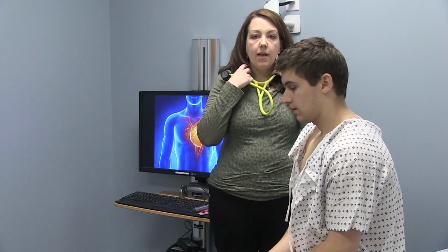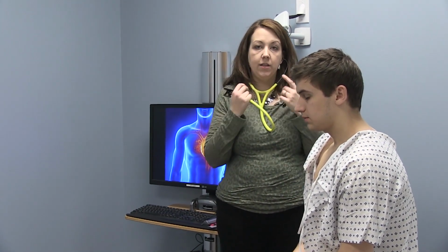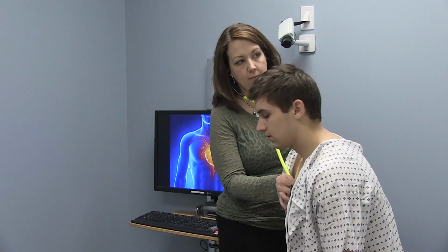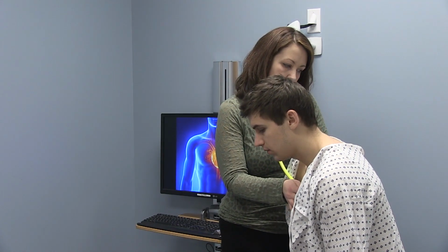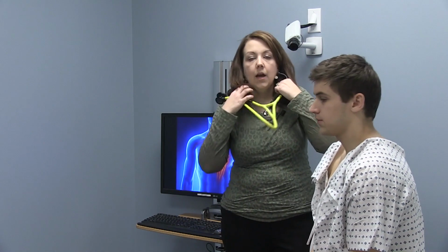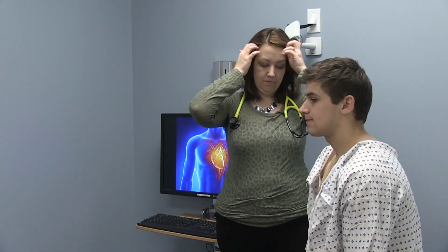Okay. Then I'm going to augment aortic regurgitation. So this time I'm going to listen with my stethoscope in the pulmonic area. If you would lean forward, and I'm going to have you blow your air all the way out and then hold it. All right, and you can breathe again. And that would just increase the sound if the patient had aortic regurgitation.